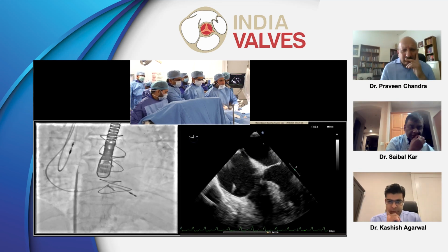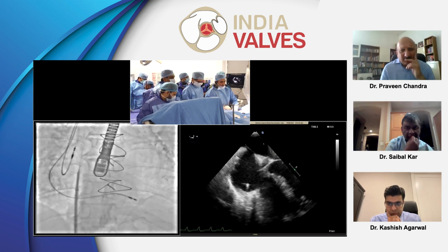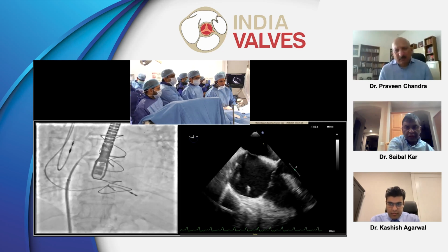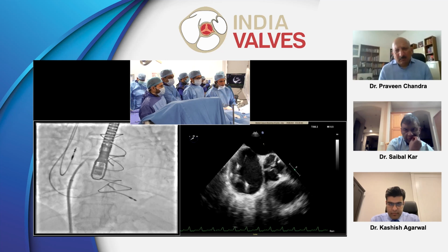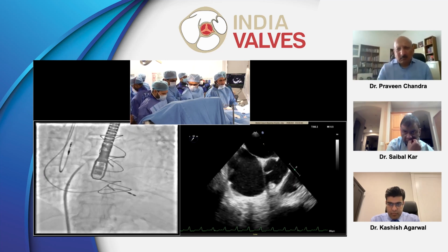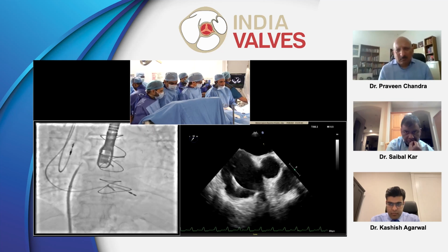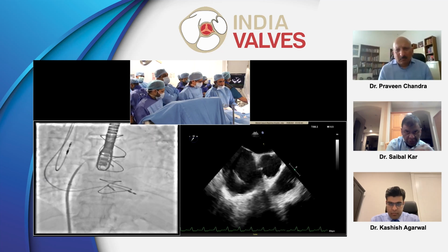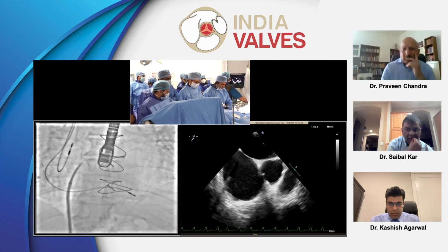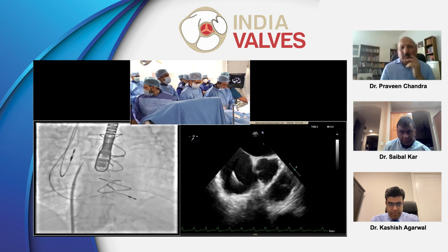Stay live on the echo, please. Okay, still in that same position, so that's good. Show me short axis once. Oh, good. Okay, so let's see. Okay, give me some dye, please. I think you're through, right? Yes, true.